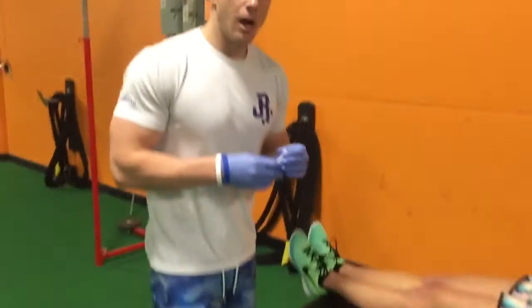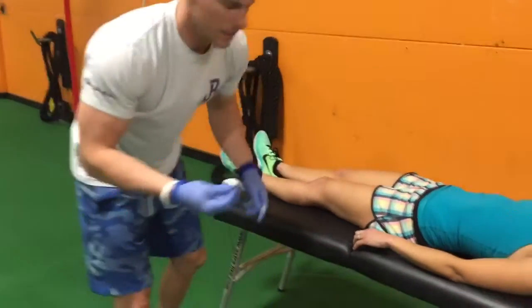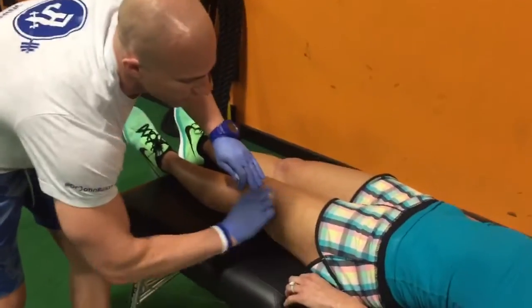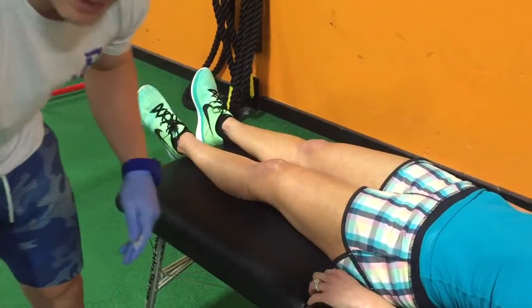What we're going to do is palpate functional trigger points, insert the needles, use an e-stim unit on them, and then retest. Since dry needling is invasive, we are going to be using a clean technique — making sure I have gloves on, that we're alcohol swabbing the area we're going to be treating, just making sure everything is super sterile.